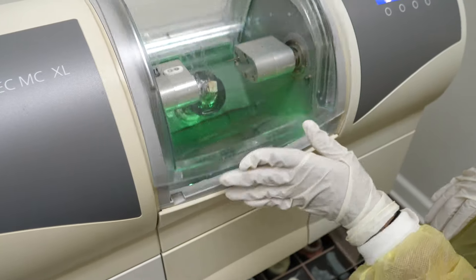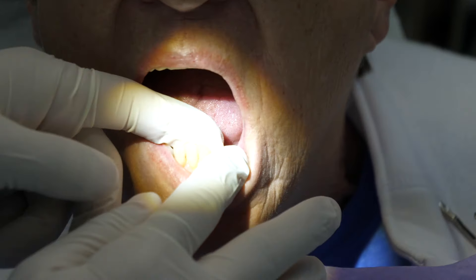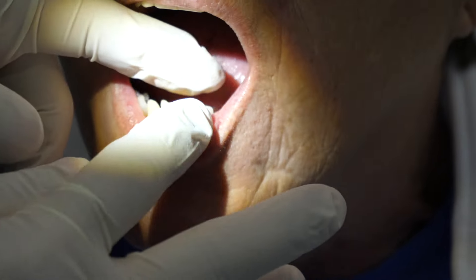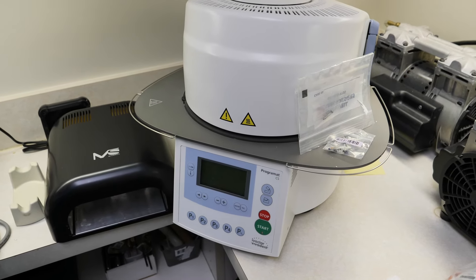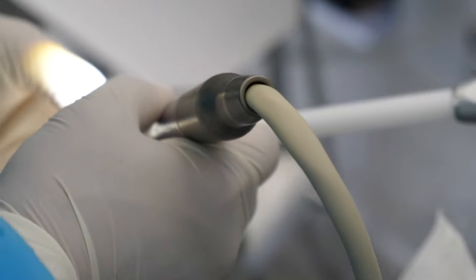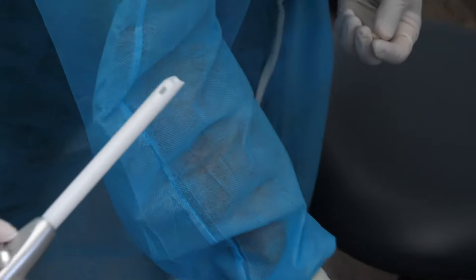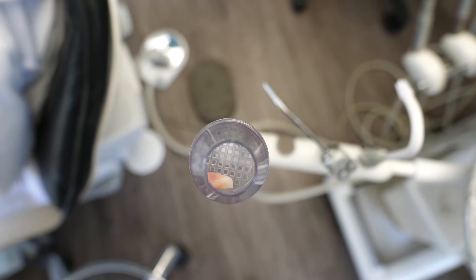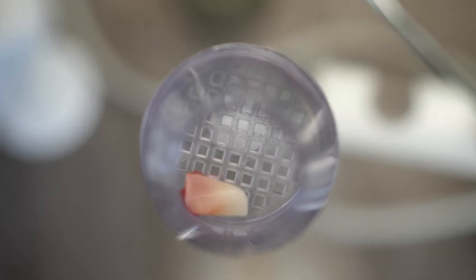After the crown is milled, they will most likely steam it and then bring it back to you for a fit test. Sometimes, depending on the material of the block, they will need to stain it, glaze it, and put it into a furnace to harden it before bringing it back for cementation. But for today's case, the material being used is already strong and the correct shade of white, so the dentist only needs to adjust and polish it before the crown gets cemented — or in this case bonded — onto the tooth.